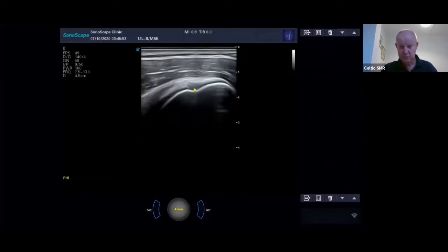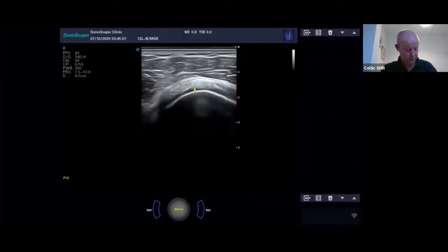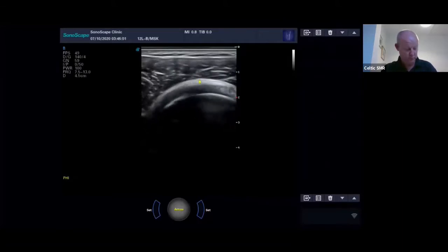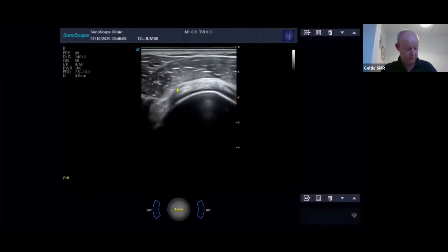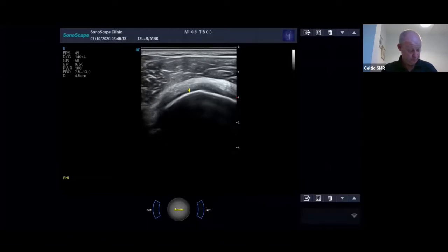There you go. And then the other thing, check for the overlying bursa. See if there's any sort of bursa thickening. Maybe a little bit here, David. Calcification, local areas of hyperechogenicity. Some of it may have a shadow behind, but some of it may not.